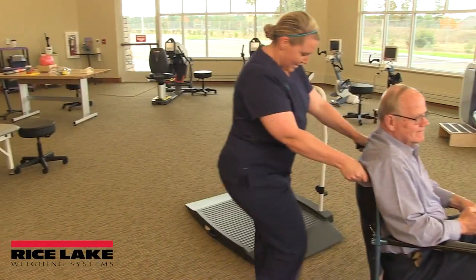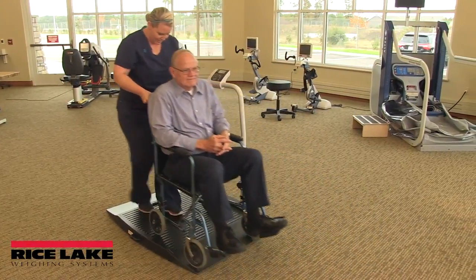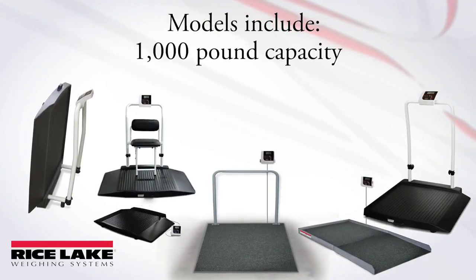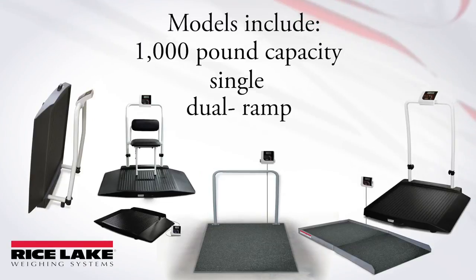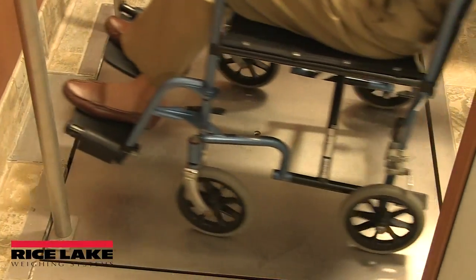Rice Lake Weighing System's wheelchair scales provide high-capacity, accurate weighments for a wide range of patients. Models include 1,000-pound capacity, single and dual ramps, and optional seat. An in-floor version is also available.